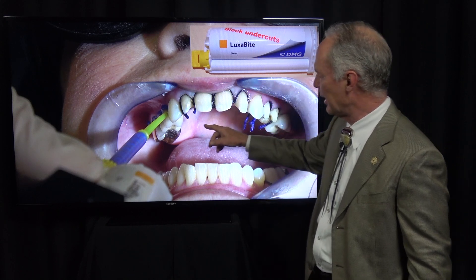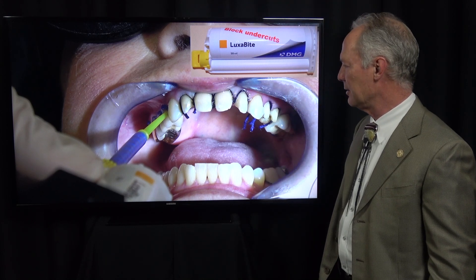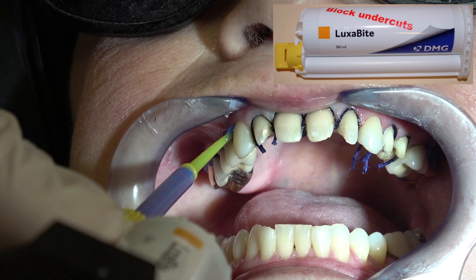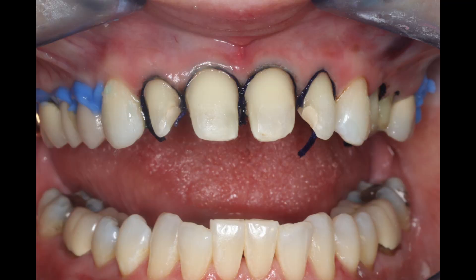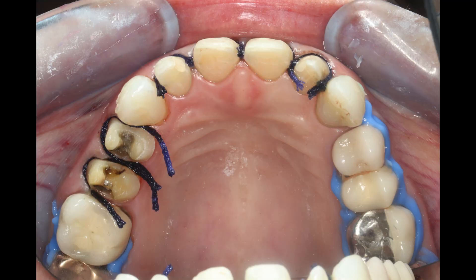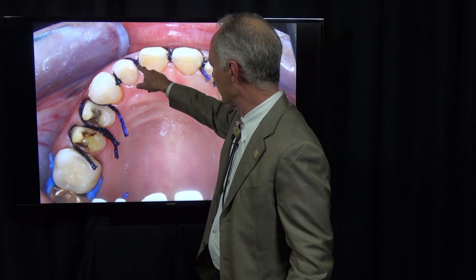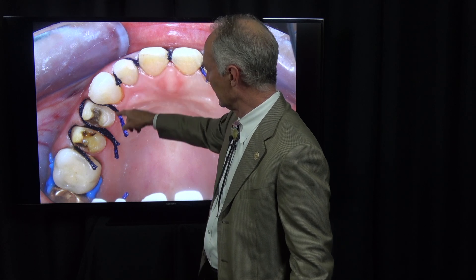This is Luxabite, which we place in the interproximal areas of the non-prepared teeth. It keeps the polyether with custom tray from locking into those interproximal areas, and it sets up very quickly. Be sure you don't get it on the occlusal surface. Here you can see the cord and the Luxabite — the cord is only partway through the interproximal, only on the facial of the veneer preps just to the interproximal facial line angle.